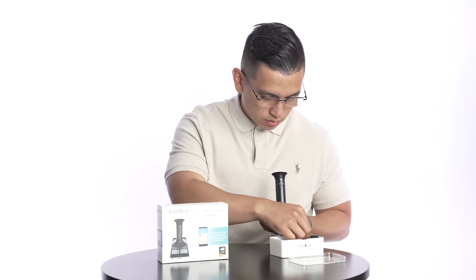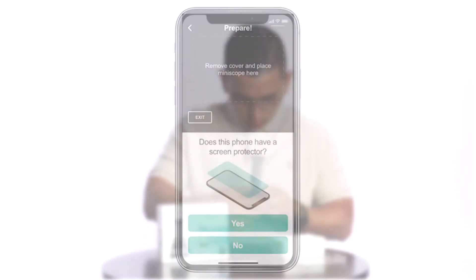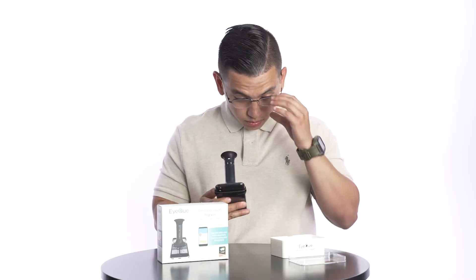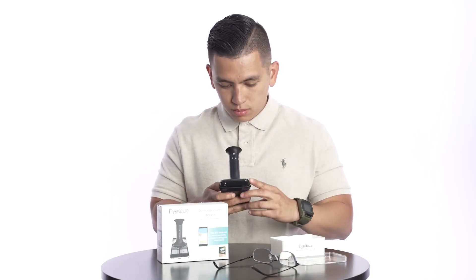Secure the device using the elastic band. Answer the questions on screen and select Continue. Be sure to remove your glasses or contacts to get the most accurate results.